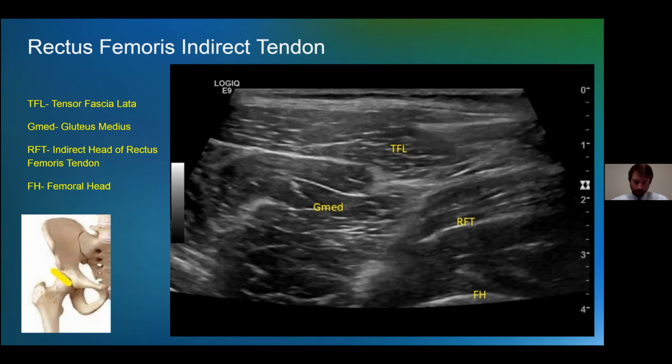So in this view, or the classic view of this tendon in long axis, the proximal portion should appear hypoechoic and the distal portion should appear hyperechoic, which is a classic example of anisotropy, just because as those tendon fibers change their angle moving around the corner, you lose sight of some of the tendon fibers. Unfortunately, we were unable to really see a clear demarcation there just because of this patient's anatomy and the sharp turn.